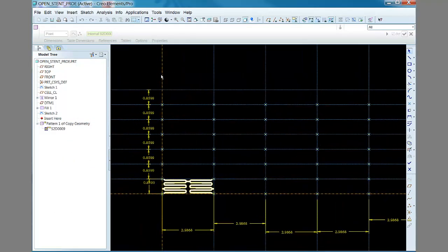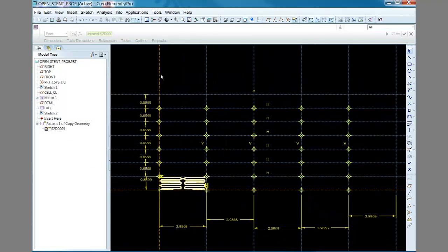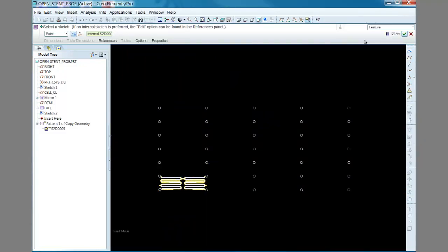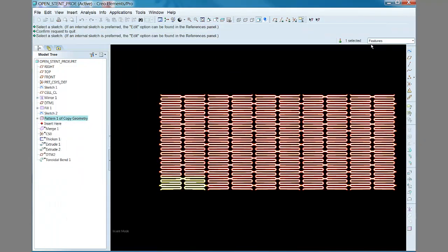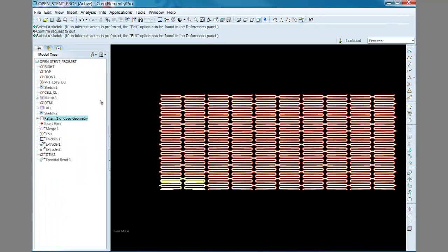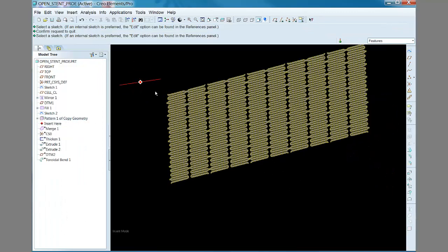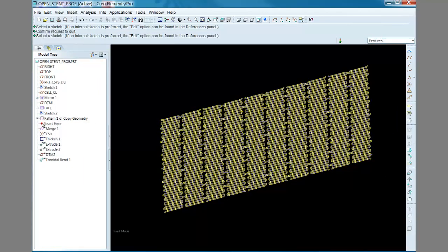To use the point pattern option, you sketch a series of geometric points and then an instance of the feature to be patterned is placed everywhere there is a geometric point. There are other patterning options available, but I found this one very useful and very flexible.